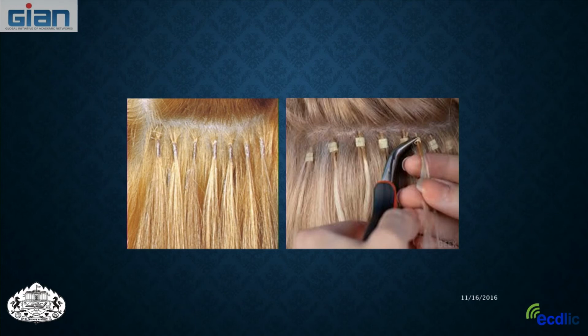So people now, here's a picture of these magnetic clips that were in her hair. So this was to put hair extensions in. You probably don't have many cases of hair extensions here because the women have such long, nice, thick hair, but in the U.S., people with thinning hair will often put these in to make it look like they have a fuller head of hair.